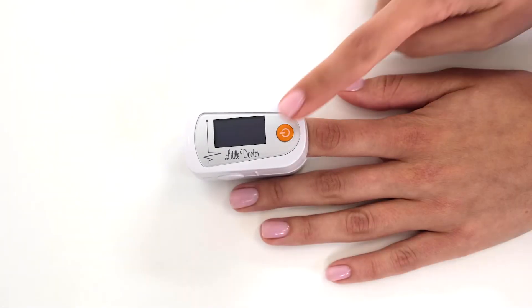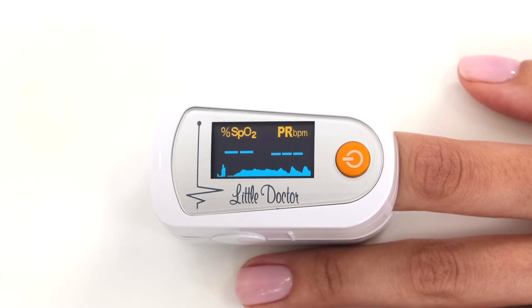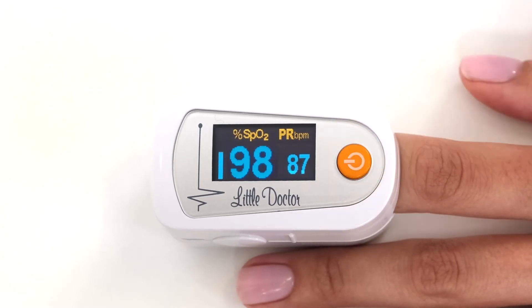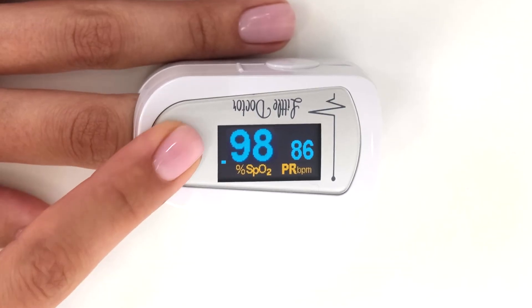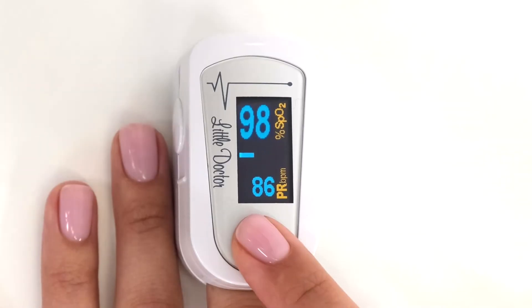For ease of use, it is possible to change the presentation of the results on the display. When you are using the device by yourself, turn the display towards you. If the doctor makes the measurement, it is more convenient to read the results when the display is turned by 90 or 180 degrees.